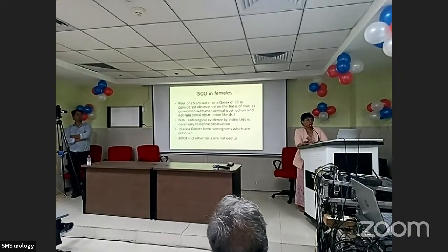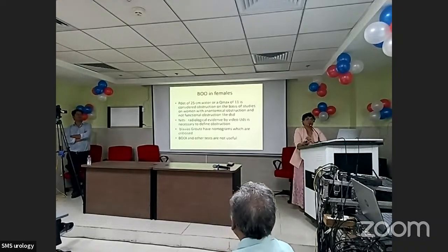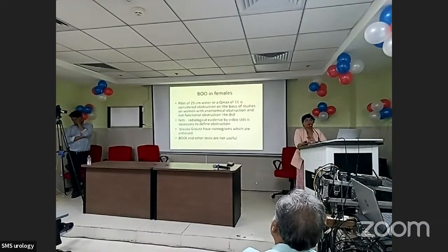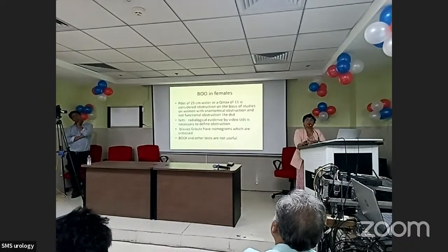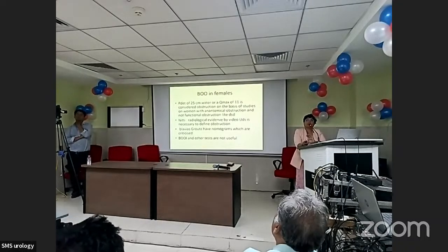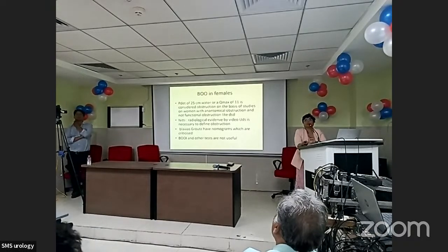I won't be talking much on bladder obstruction in females because sir is covering a separate lecture on it. But only urodynamics is not considered as the diagnostic or the gold standard for diagnosing obstruction in females. It has to be supported by clinical evidence, calibration, cystoscopy, or radiology. So this is only one statement I want you to remember out of this slide.